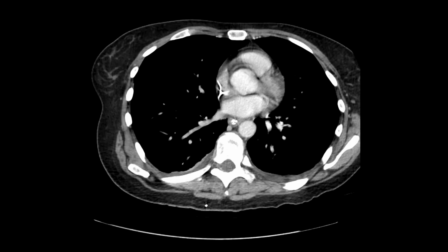So, yeah, they tend to order an upper GI or an esophagram to rule out a leak. And to me, knowing what I know about doing a fluoroscopy study and doing a CT, it's just obvious to me. You get so much more detail, so much more information in a CT scan.